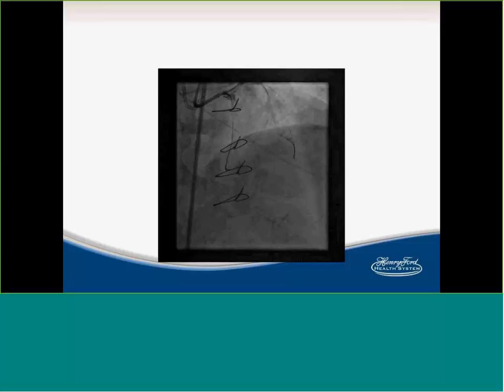But in this case, there are some cases where things can happen. You put a lot of stent in the native, so we're going to go fine. But I'm not sure I would coil it, because if something happens, you may have a second option, and if the vein has a poor flow, it's going to close by itself potentially. But I understand there's a limitation. You might have competitive flow and potentially damage your antegrade flow and cause issues there too. So personally, I wouldn't, but I don't know. Okay. I know there are different opinions on this.